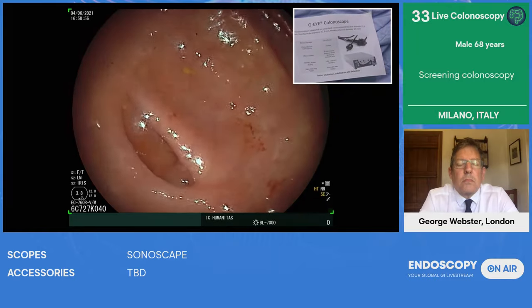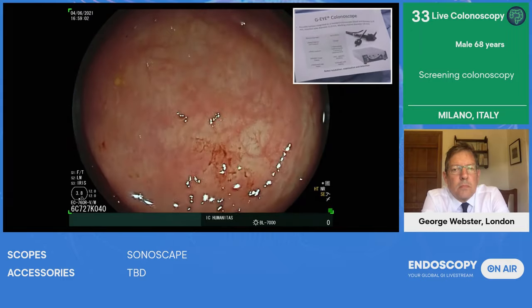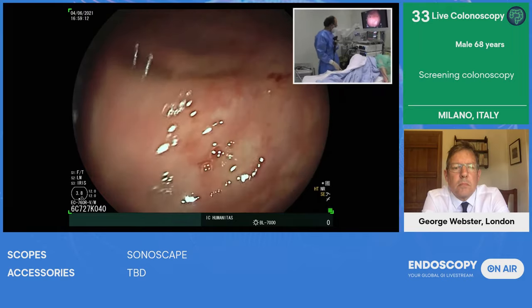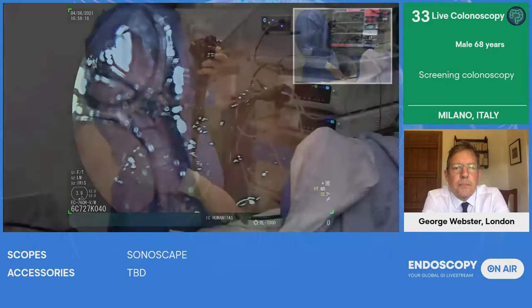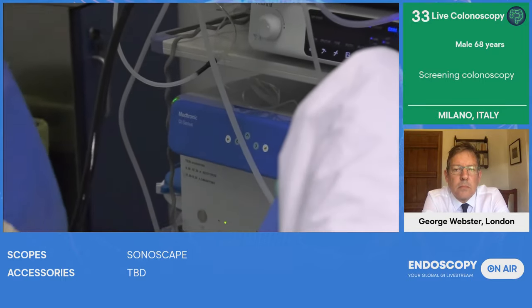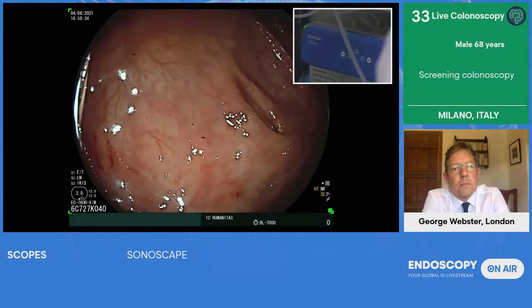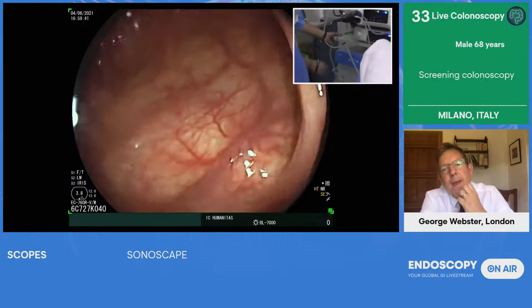In addition, in doing this endoscopy, I'm not alone, despite there is no one around me. But can you please focus on GI Genius, that is the artificial intelligence distributed by Medtronic, and validated here in Humanitas by Alessandro, that helps in detecting the lesion. So when I scope, I'm not alone. My attention is mainly on navigation to expose the mucosa. And I learned in these years to interact with my AI machine in order to differentiate what is a false positive like this that you see now and a true positive that is the lesion.